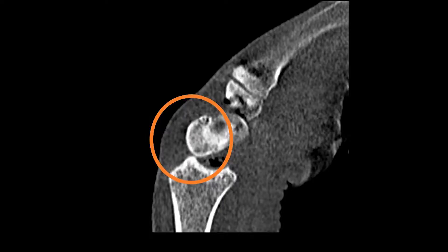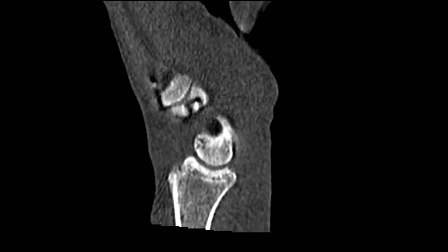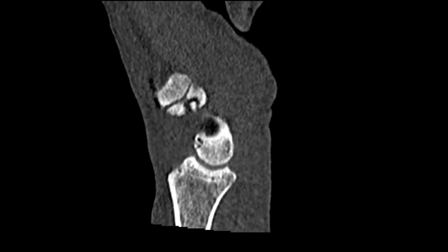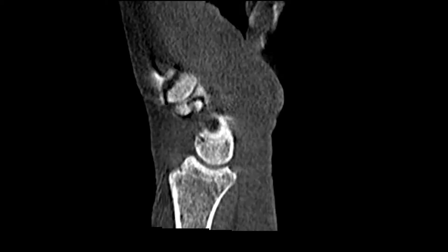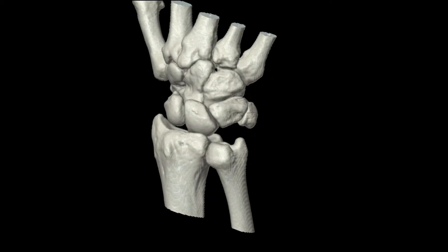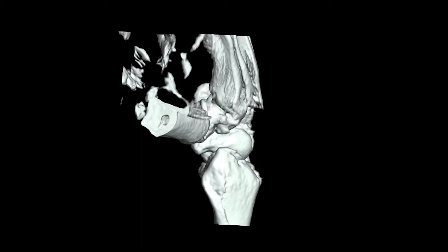In the first case, this was palmar and dorsiflexion which was causing the clunk, and this manoeuvre was able to demonstrate scapholunate instability, which we were able to see on the imaging. There was the classic appearance of the scaphoid going dorsal to the radial fossa.